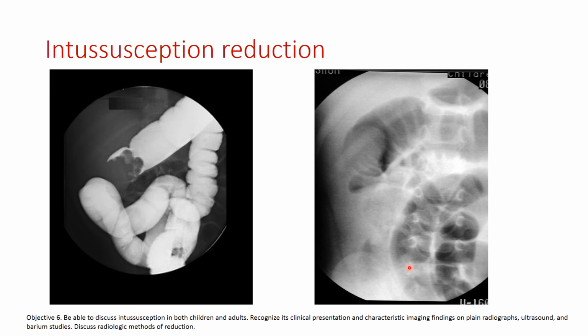And I've included a YouTube video that talks about intussusception and air reduction. There are people that are doing water reductions under sonography. I've never done that, but that's being done now in some places.